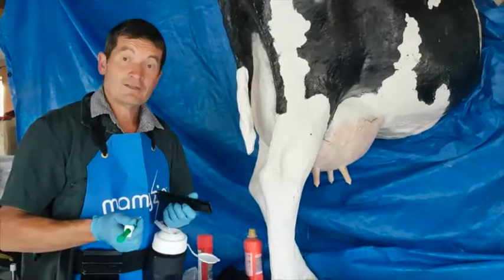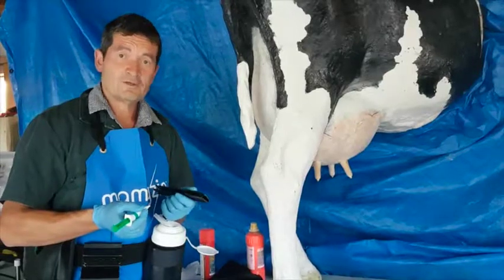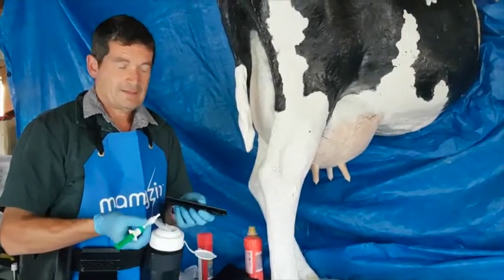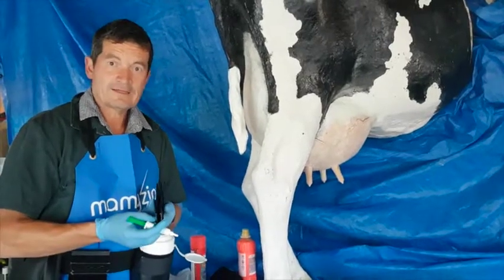Hi, I'm Richard from EZ-Treat. EZ-Treat is an animal treatment system. It started with the job of teat sealing when we wanted to be quicker, cleaner, easier and safer.